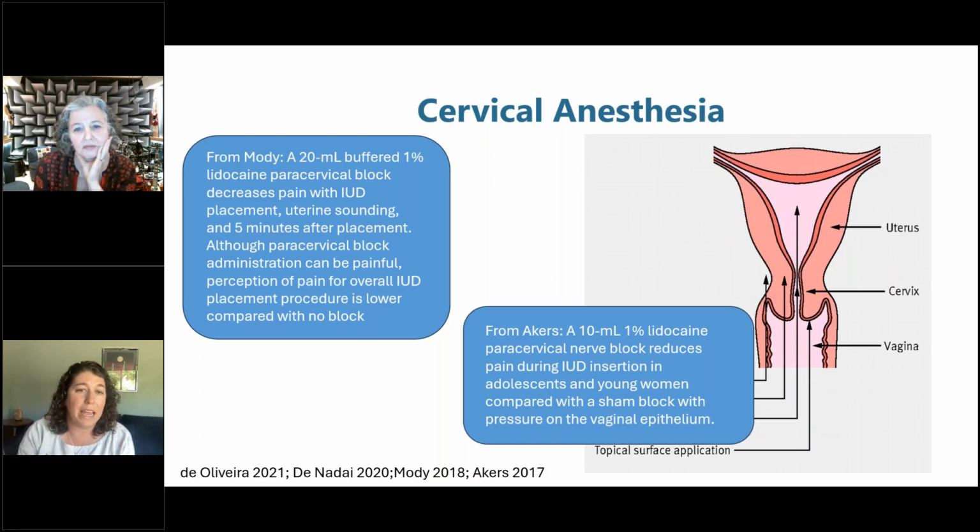There was also a study by Akers that looked at a 10 milliliter paracervical block, specifically in adolescents and young adult women. They compared that with a sham block, and again it was shown to decrease pain.